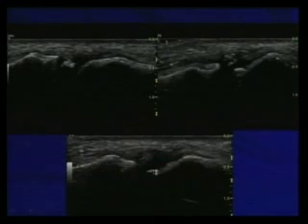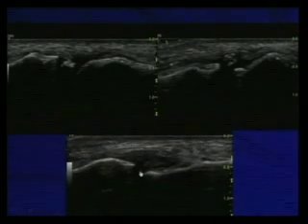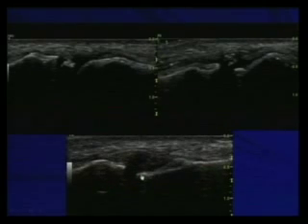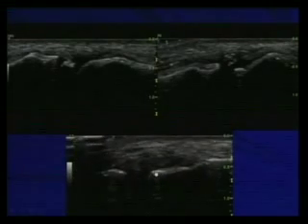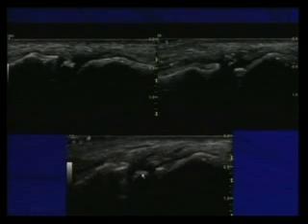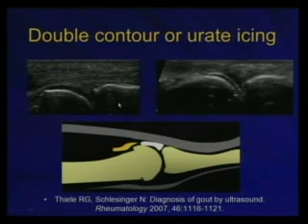Then we push a little bit more to explain the symptoms that we're looking for, and you can see that the structure disappears completely in the joint. So this is not calcific periarthritis. This is intra-articular, and this is a true loose body that was locking the joint. See here, the structure falling into the joint. So this is the structure on plain film, here in the joint, and they remove it.